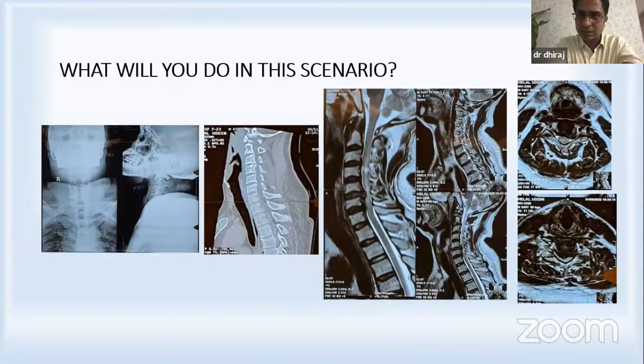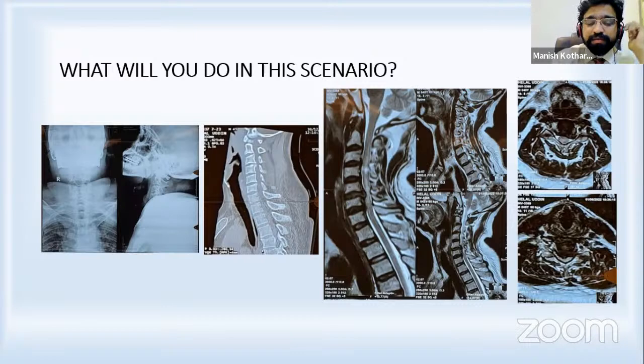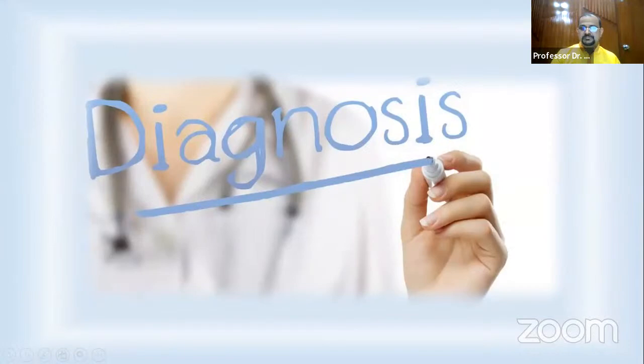Dr. Jonah, why do you call this a hematomyelia? Which one? The one just opposite the C4. Yeah, this is a 15-day-old MRI, so this is a 15-day-old bleeding. The signal changes in a hematomyelia will be far different than what is seen here. To call it a hematomyelia, you will also need to show us the T1 images and possibly contrast also. This is most likely ascending cord edema rather than hematomyelia.